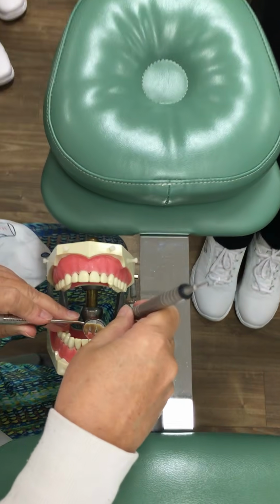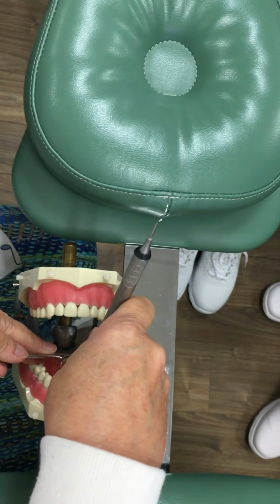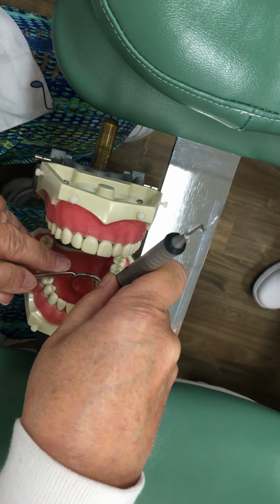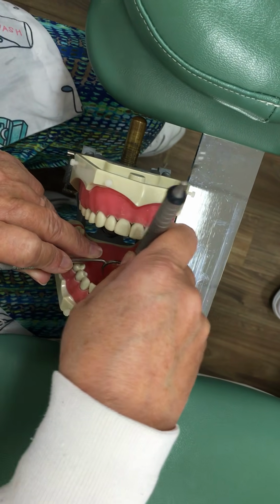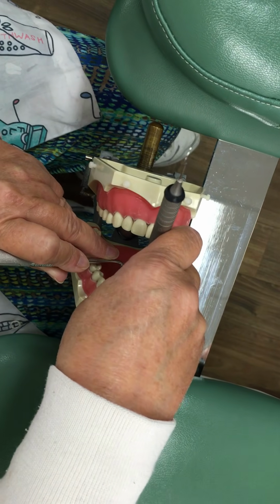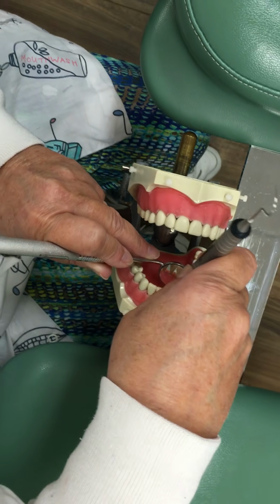And we're going to use complete indirect vision, again a modified pen grasp. We're going to stand up straight and tall on our fulcrum and lean our hand toward the lingual, which means we're going to probably hit these maxillary teeth. That's okay.